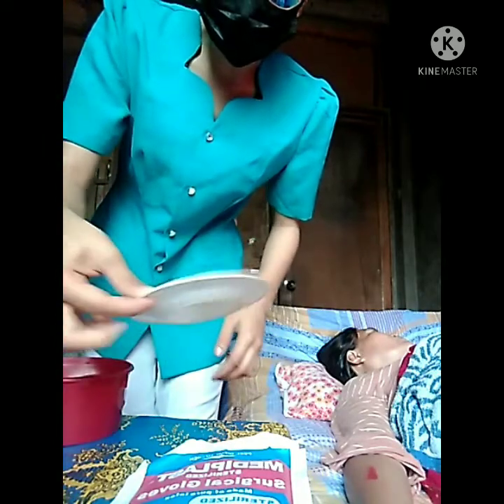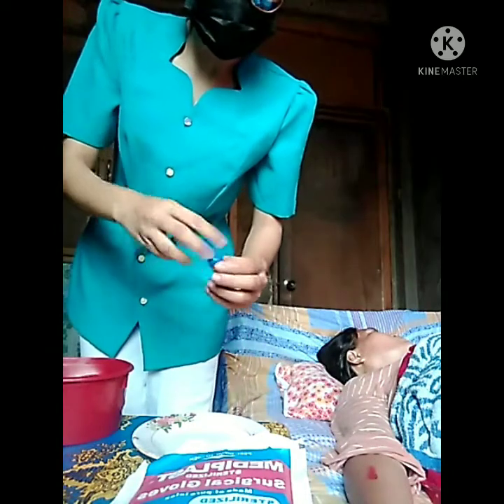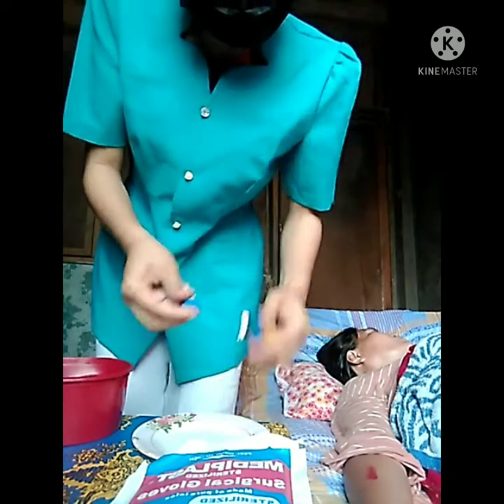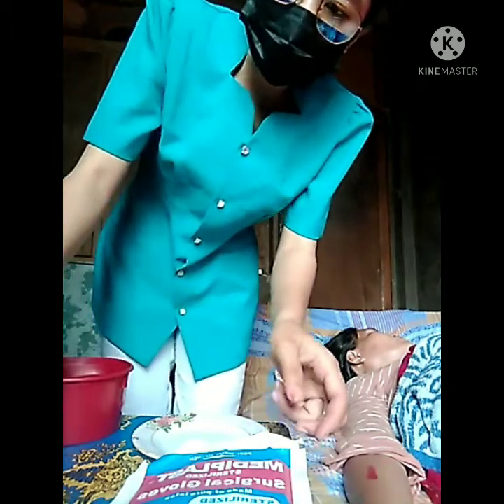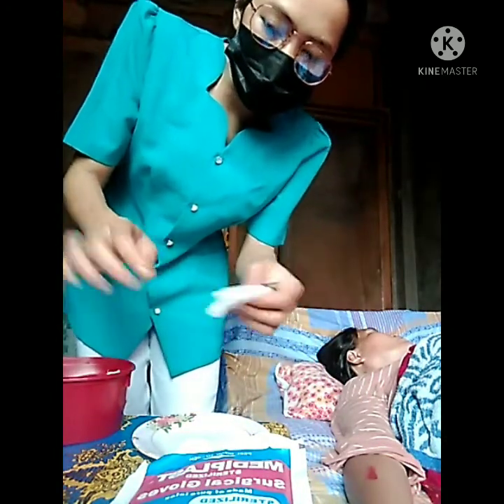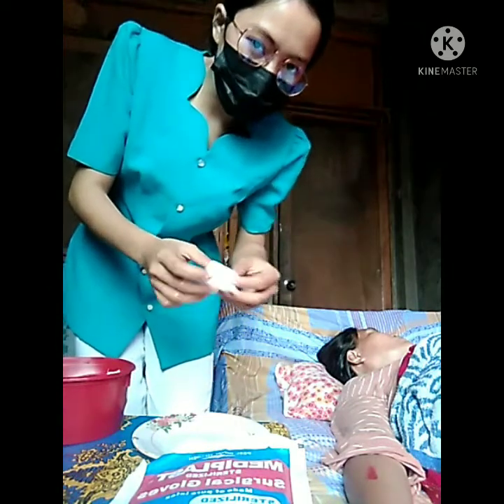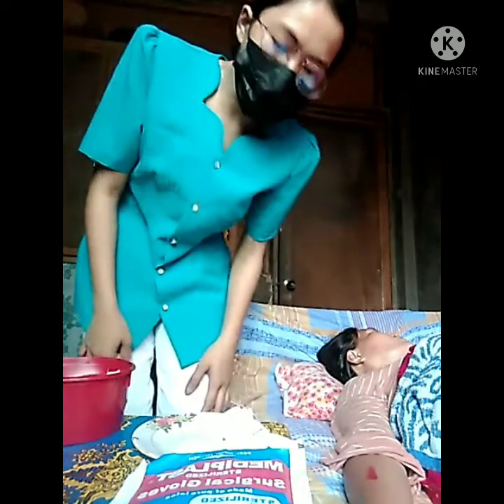So this is my sterile basin, and then put a betadine solution as prescribed by the doctor, and then put the fine mesh gauze, wet, into the basin with the solution.